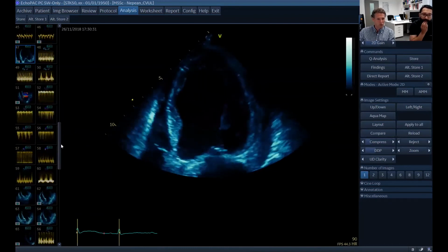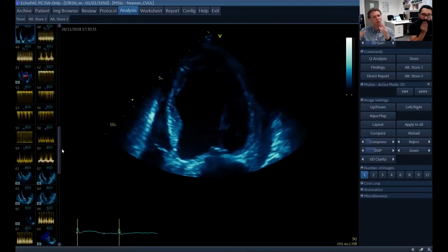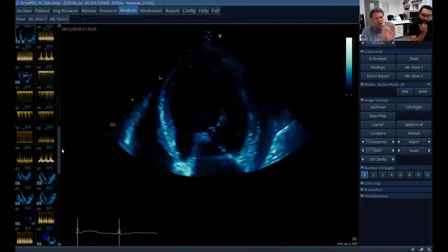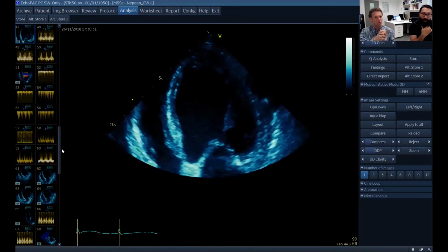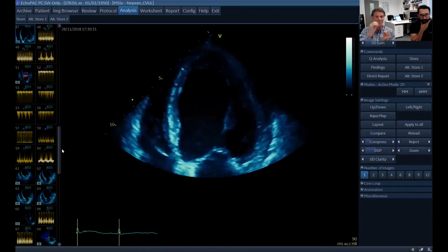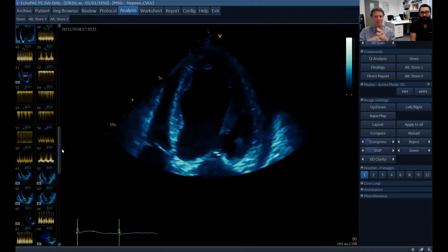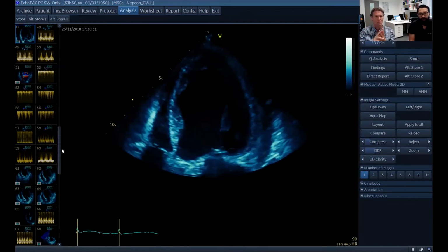Awesome. All right, so I think we'd have clinical features with this patient that fitted with tamponade. We've now got echo evidence that backs it up in terms of free wall collapse. We haven't seen a bouncing septum, and sometimes we can see that. And that's because we've got raised left ventricular diastolic pressures. I think we need to drain this effusion.